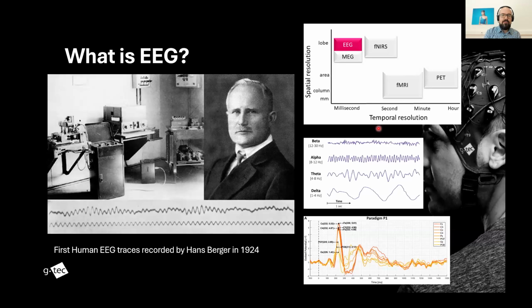So you have seen also in the previous lecture, Martin talking about the frequencies, how we're going to see different frequencies on the EEG. You have seen how by closing his eyes, Sebastian was able to induce some alpha activity on the screen. So you see these higher amplitude EEG traces.